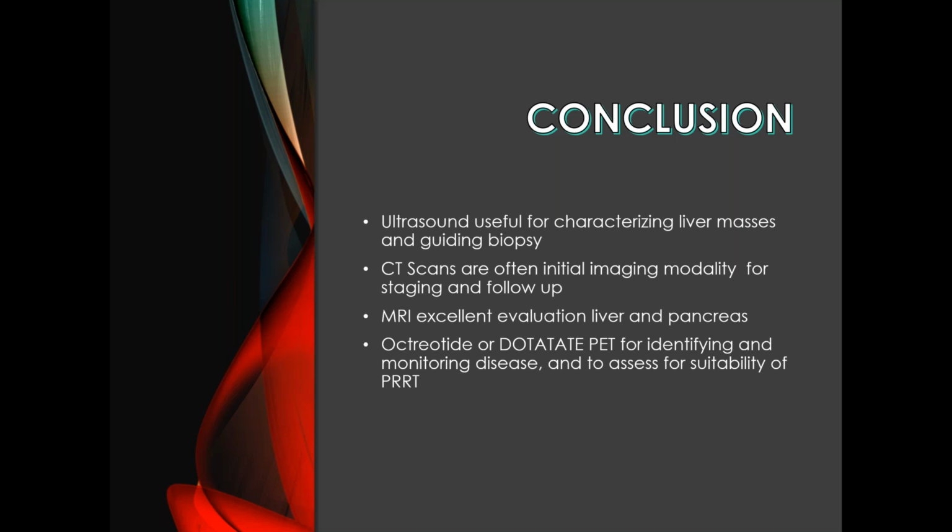So at this point, I would favor the MRI. The 0.5, that is different. And I would maybe talk with the radiologist, go back to the person who read the MRI and say, well, this is the DOTA-TATE. Is there really a difference? Is this the same thing that you're seeing? And have them really correlate those two imaging studies.